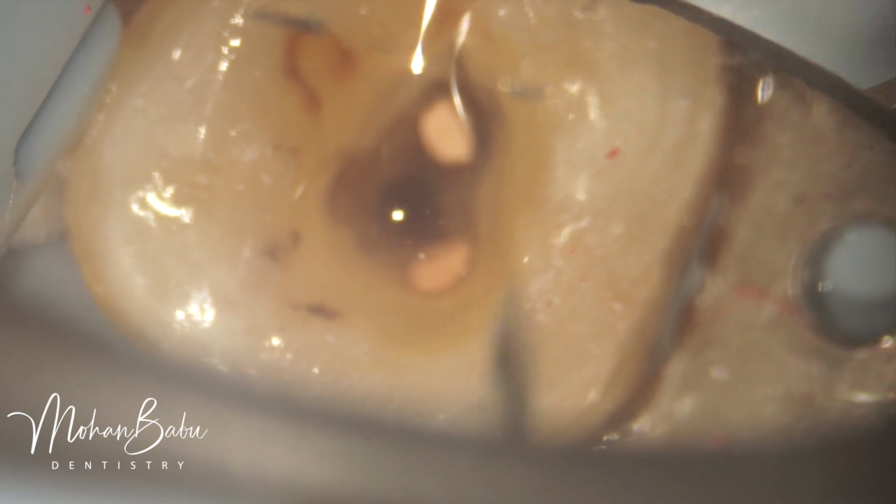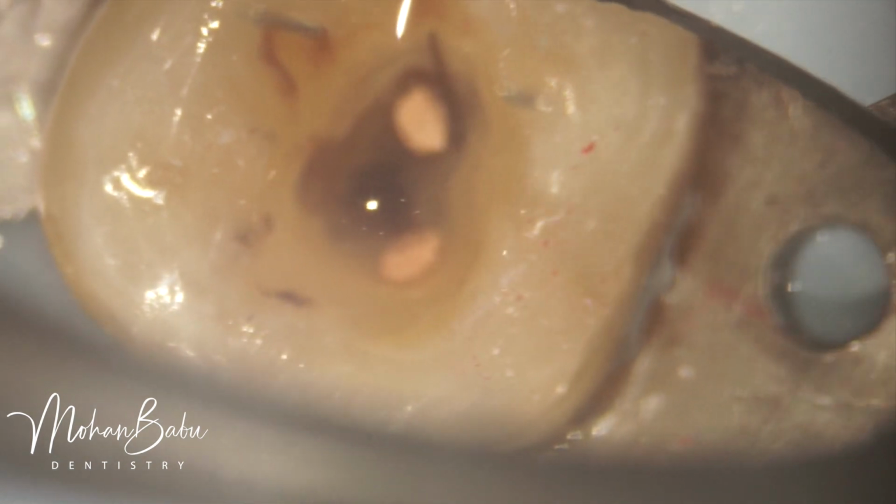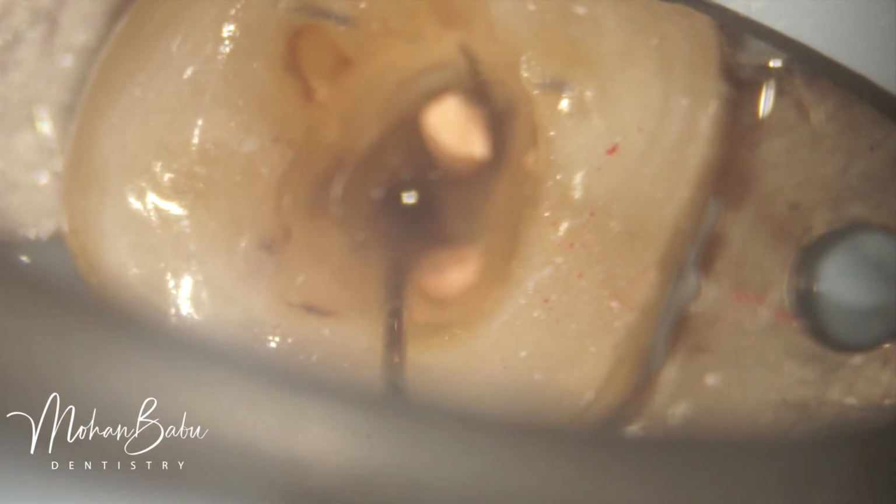In this situation, we may use some kind of latest instruments to catch the file and bring it out. Nowadays we have a variety of instruments which usually do very well. Here I opted to tease the file out, but it was not happening for some time. So in this particular case, I flushed some saline inside, and the force of the saline just brought the instrument out, and the instrument is now sitting in the distal portion.